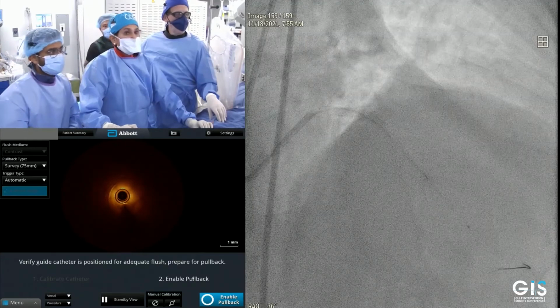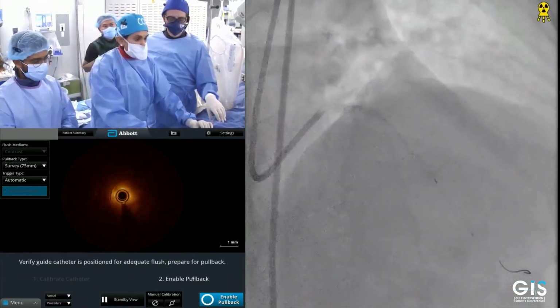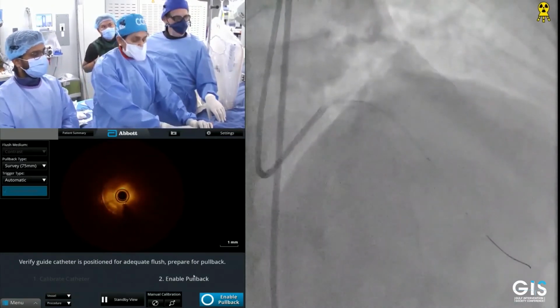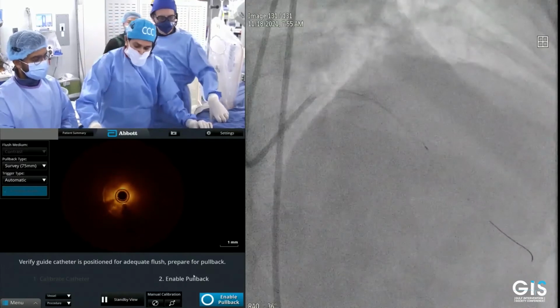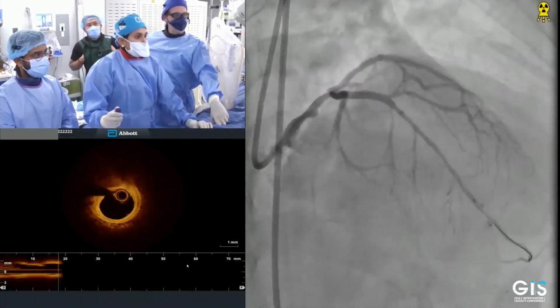But we don't do this. So we don't do pot with... Is that because of the previous incidents of leaving wire behind or something new? Yeah. Because now we do it different. We keep the wire there. Okay. Yeah, but in the heavily calcified lesions we don't.